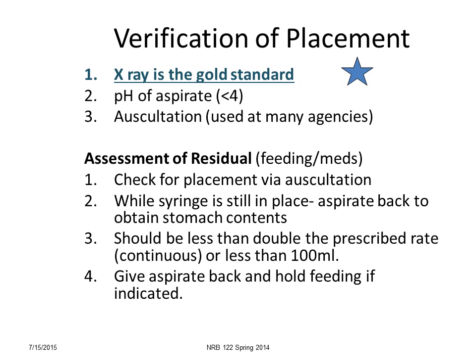Now we're getting into the crux, the really serious part of nursing. How do we check the placement of this tube? This has been debated since I was a nursing student, and now research has demonstrated that the best way to check for placement is to do an initial x-ray. This is usually a portable x-ray done at the bedside, or you may send the patient down to x-ray depending upon your agency protocol, but typically it's a portable chest x-ray.